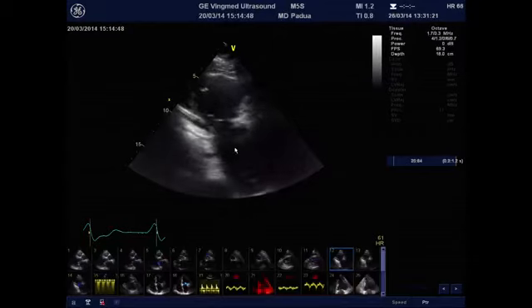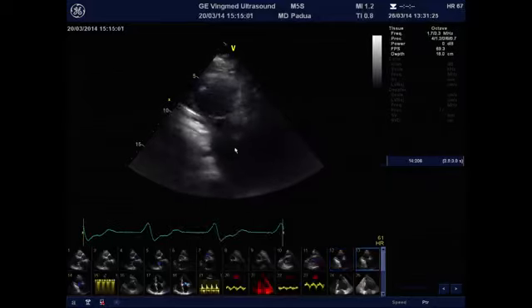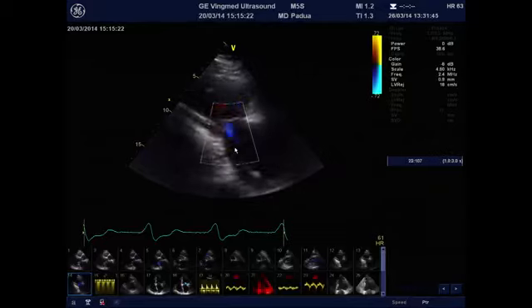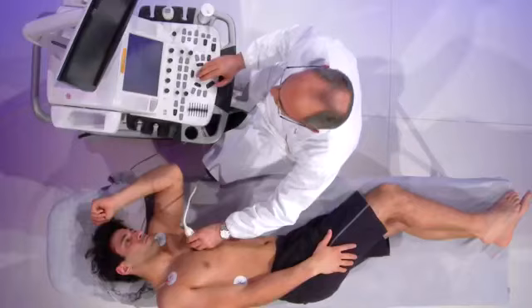This is the right atrium, and what I have to look at here is the position of the wire within the tricuspid valve, and also the presence and the severity of tricuspid regurgitation. Tricuspid regurgitation is quite common in patients, particularly those with old heart transplants, since it is quite a common complication of the frequent endomyocardial biopsies that these patients underwent during their follow-up visits.